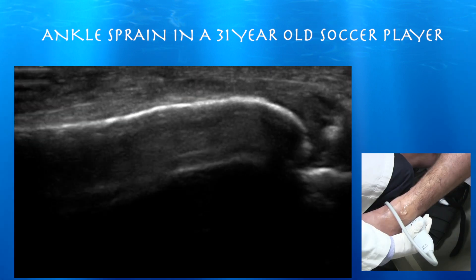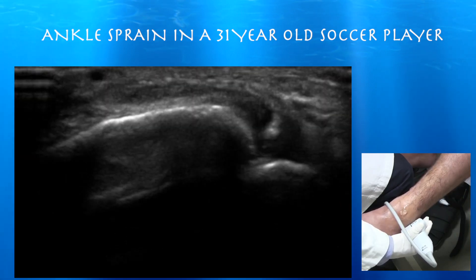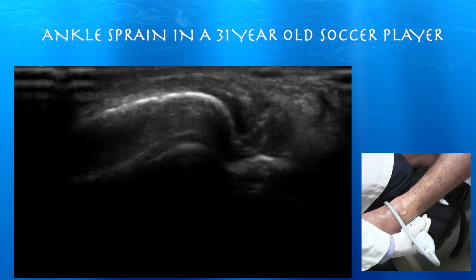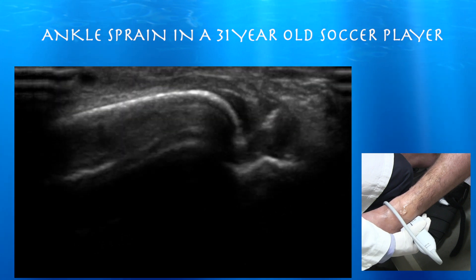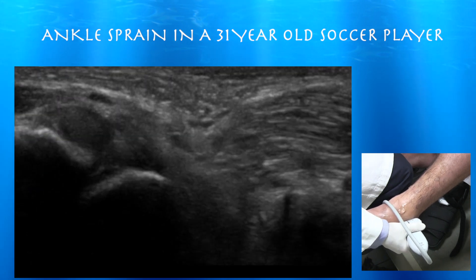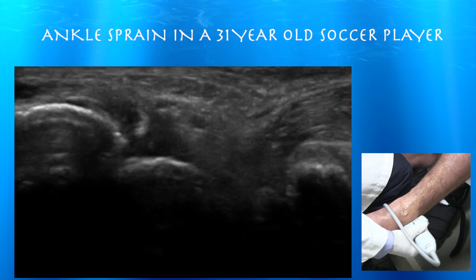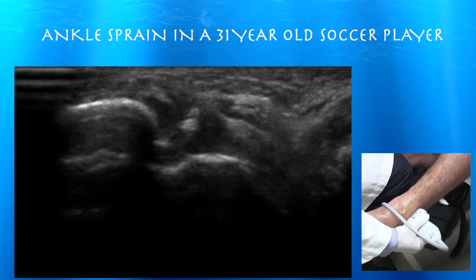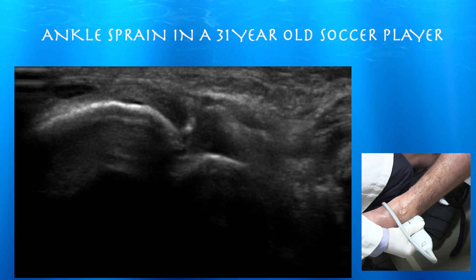Here is the fibula, and on the ultrasound you can see a little speck of calcification — much clearer than on this x-ray. Here again is this calcification from an avulsion from the distal fibula. You don't really see any ATFL; you just see some hypoechoic signal in the region where you would expect the ATFL. It's had injuries in the past and is barely visible on x-ray. So this is a case where ultrasound clarifies your x-ray.